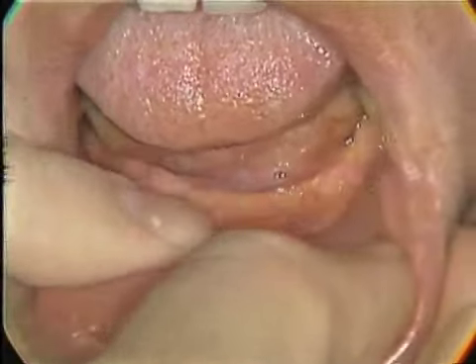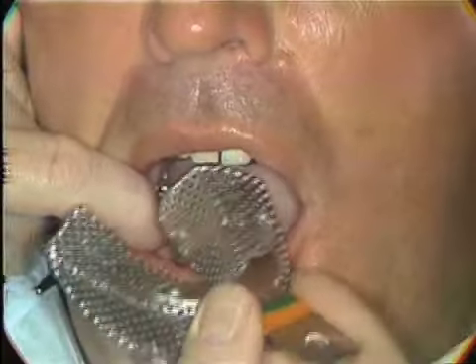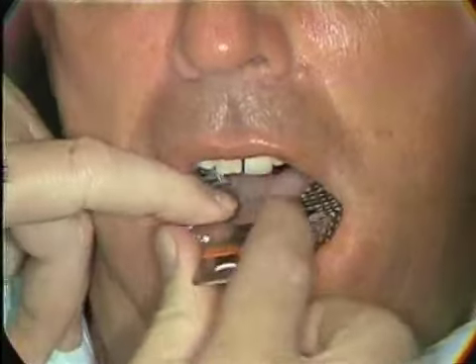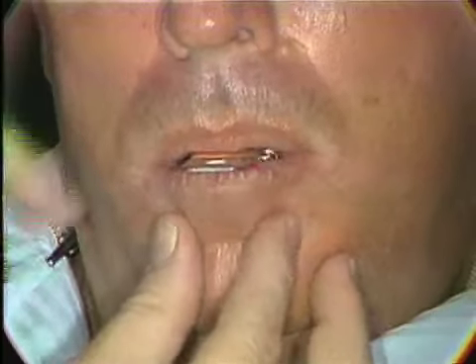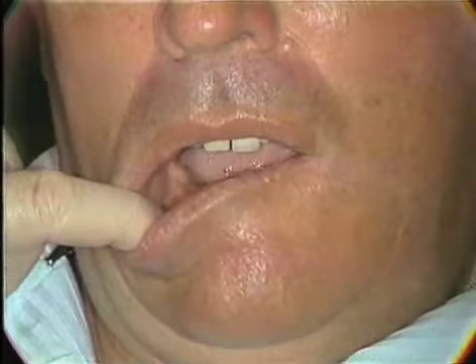So we wouldn't want to have our fingers in the mouth. Also, the size of the tray that we would use would have some effect on this peripheral tissue. If we use a large tray, such as the alginate tray here, we can see how that would distort these peripheral tissues, and the patient cannot bring the teeth together in this rest position. So the size of the tray has a lot to do with the peripheral edges.